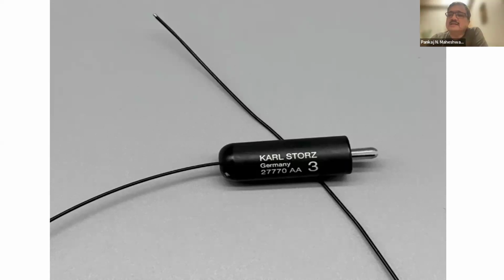So the way to answer this question will be that I would try to assess whether it's a diffuse ooze or a pinpoint arterial bleeder. If it's a diffuse ooze, then put in a catheter, give external compression. Most of these bleeders would stop on their own. If it's a fresh arterial bleeding, then you will need some form of coagulation. If it's a small bleeder, then Bugbee electrode. If it's a large bleeder, you could use an electrocautery loop and coagulate at that place.